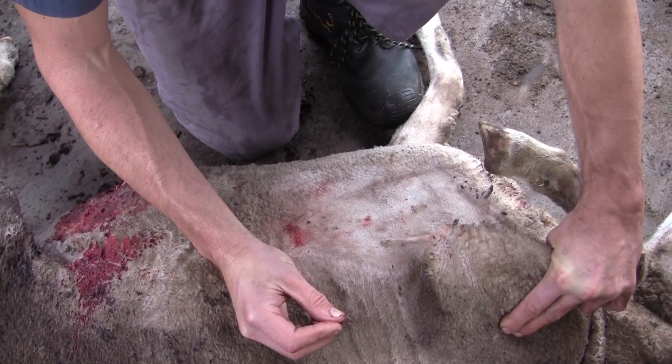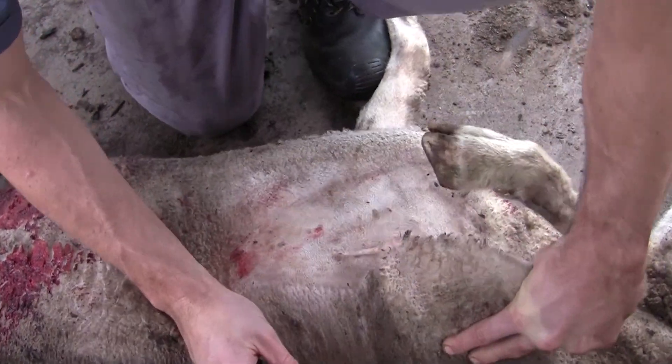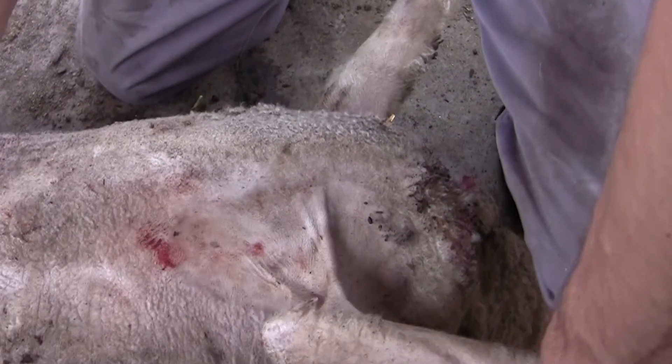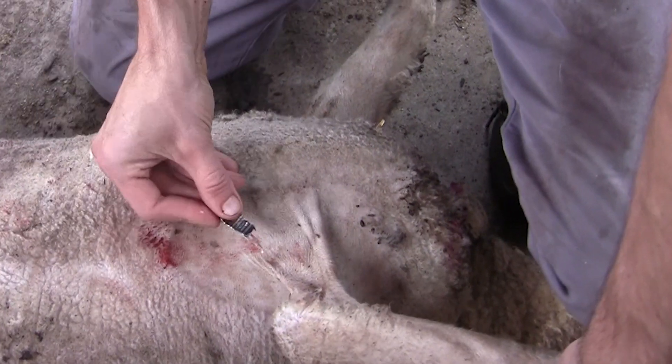What I wanted to demonstrate to you today is the correct method of suturing quite significant shearing wounds. We've got a deceased sheep and we are explaining common areas where shearing wounds can actually occur.